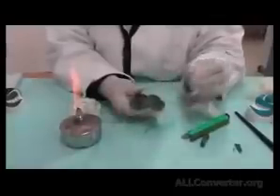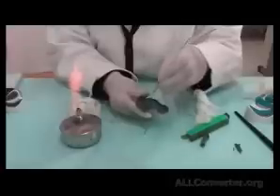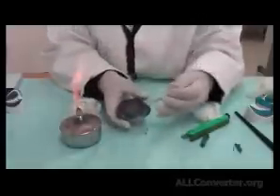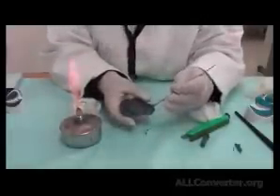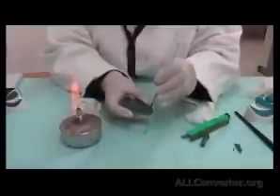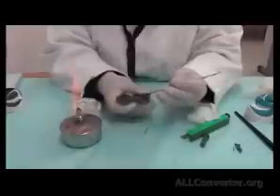So I'm looking back at it. Anything in the middle, in the rafi area, I'm removing it. I'm leaving the part of the green stick on the fitting surface only on the lateral sides. Anything here, tuberosity areas, try to reduce it. And what I'm leaving is like an arch shape of material. I'm going to repress it inside the patient's mouth to finalize this area. So I'm removing excess that I think is excess.